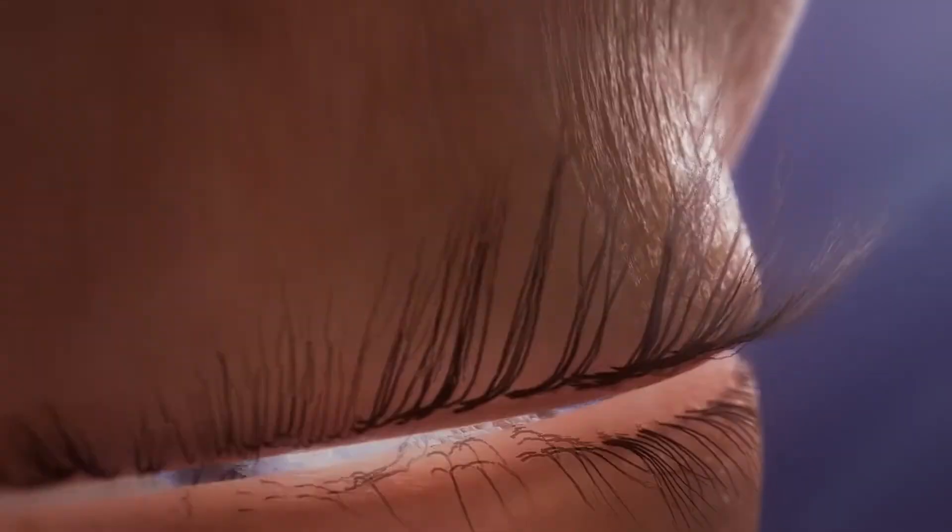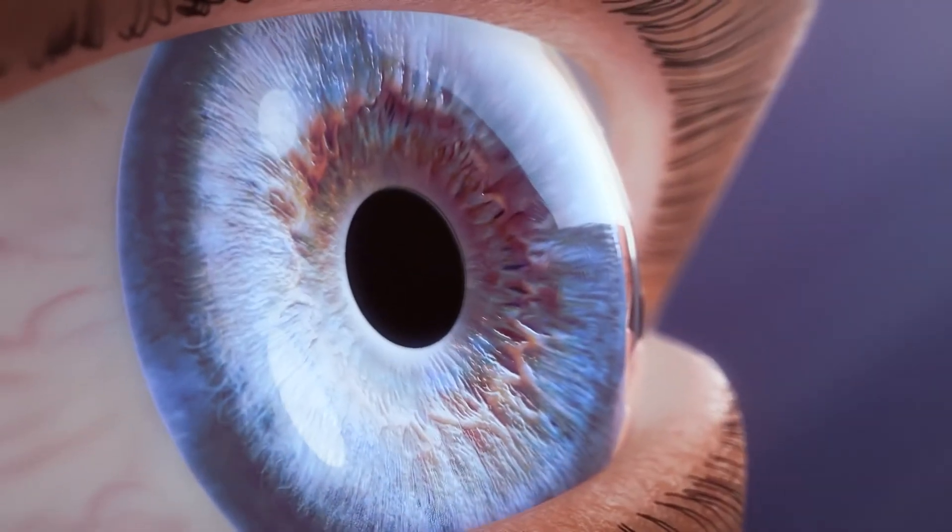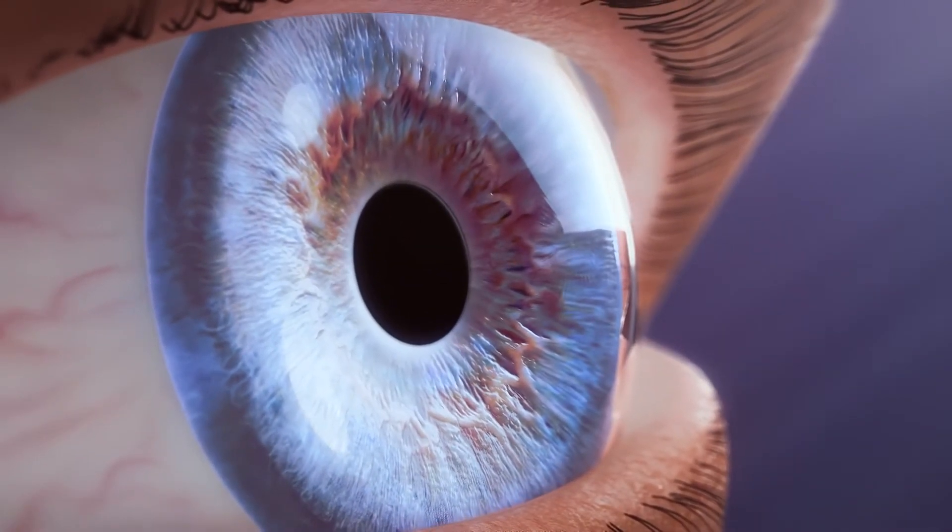Elios, a next-generation, innovative technology for the treatment of glaucoma.